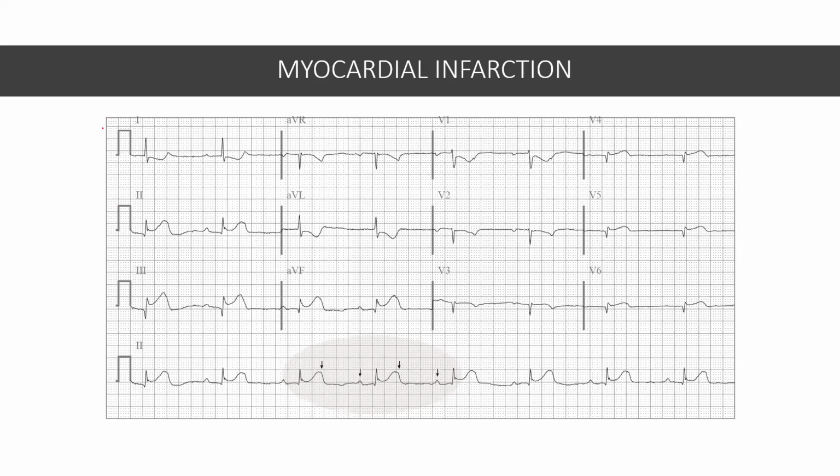So let's take a look at the standard. Is the standard normal, or is it half standard or double standard? Your answers? Normal standard. How do we know that it's a normal standard? Again, we count the number of small boxes going up, and this is 10, and therefore this is normal standard.